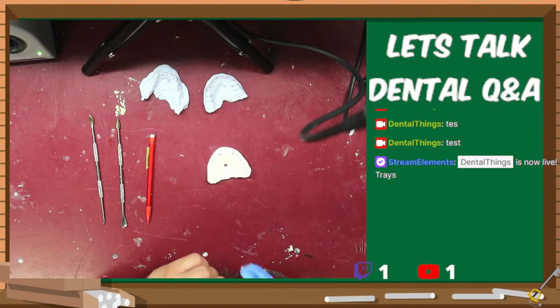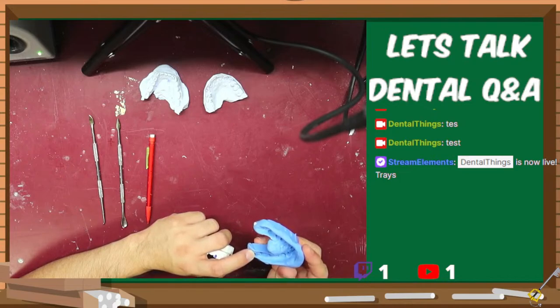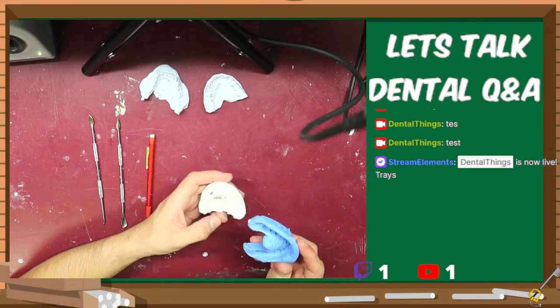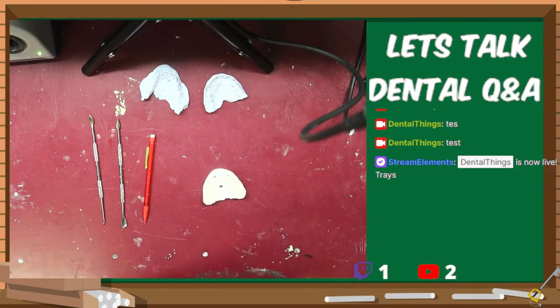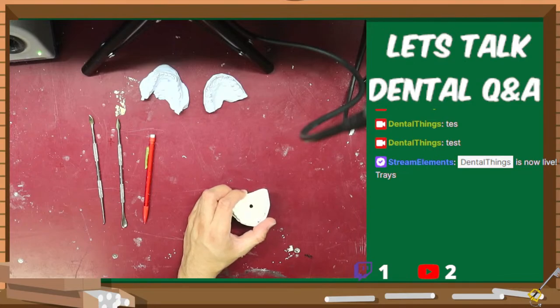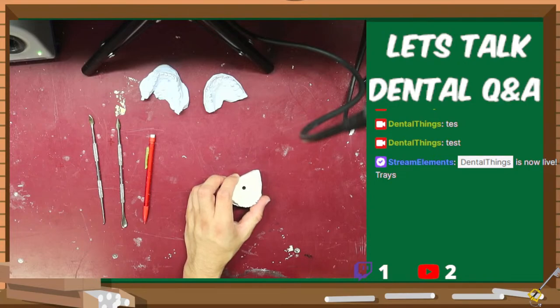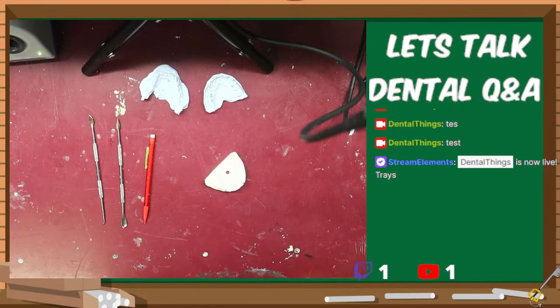This may be it, but this person's missing a tooth on their upper left. They're missing 15. And not there, which doesn't match this one at all. So that's not their impression. And then that's not one. I may need to take a new impression for this person. Who's this? Nah. Okay. We'll work with what we got here, and then we'll move on from there.